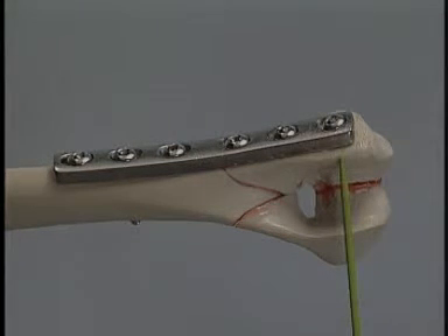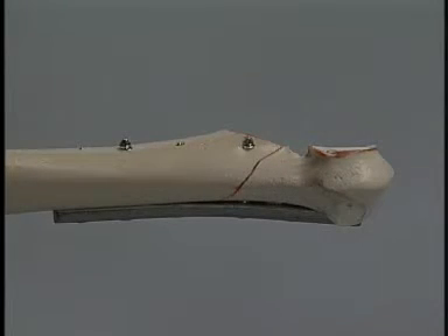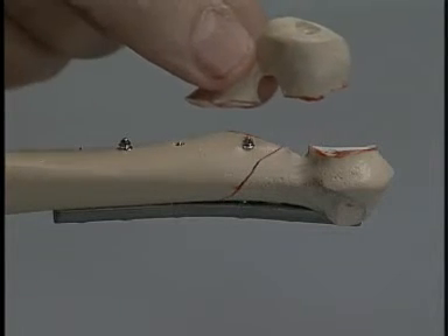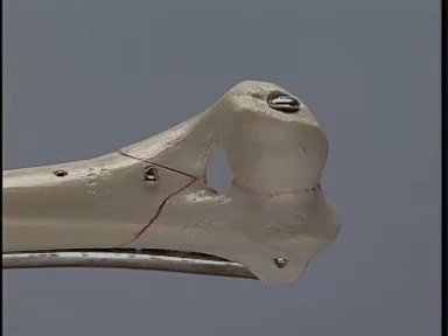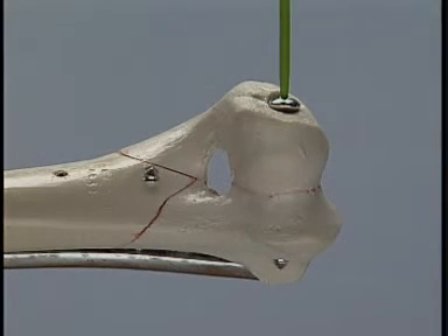Depending on the conformation of the bone and the position of the plate, the most distal plate screw may be inserted through the condylar fragments. In some cases, the proximal and distal medial fragments may be reduced and stabilized first. The lateral fragment is then secured with an intercondylar lag screw that provides compression at the fracture site.